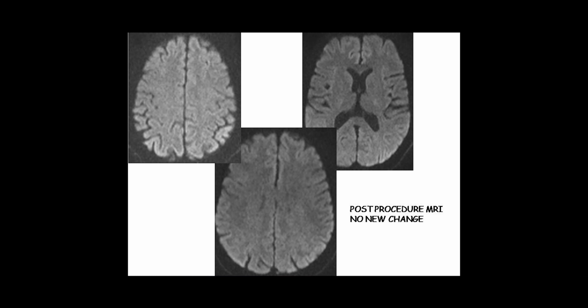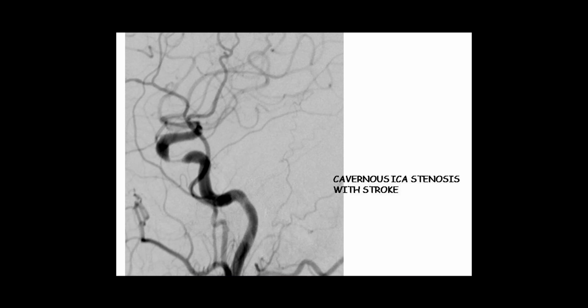And this is the scan that we do after the stenting. You can see that there is no further stroke happening because of the stent placement. Now, this is another example. I'll just finish with another example.